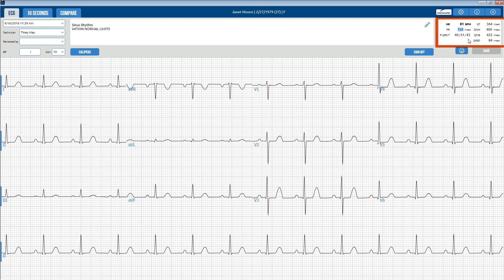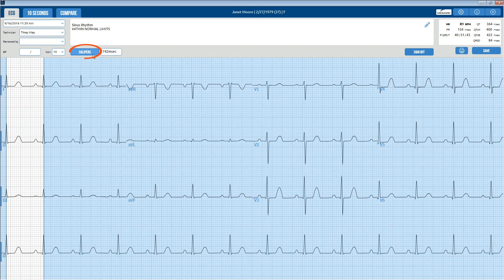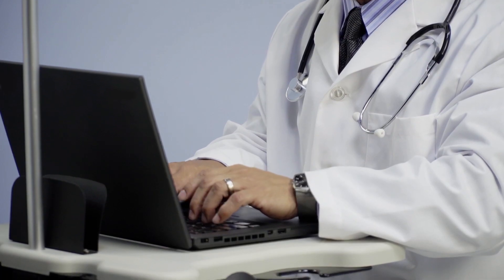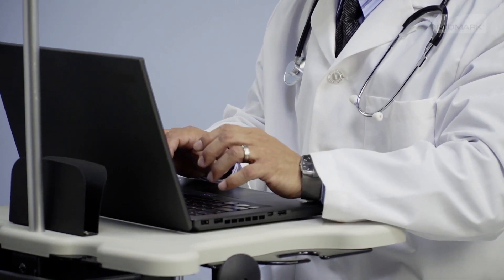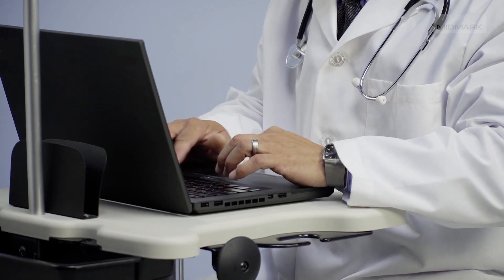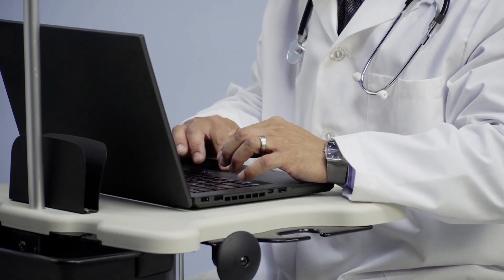Measurements can be manually overridden by clicking in each field, except for the QTC values. Click the Calipers button to measure the amplitude and duration of any part of the ECG waveform. This makes it easy to review ECG tests online without printing the report.